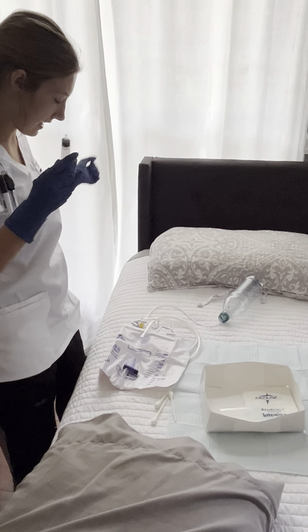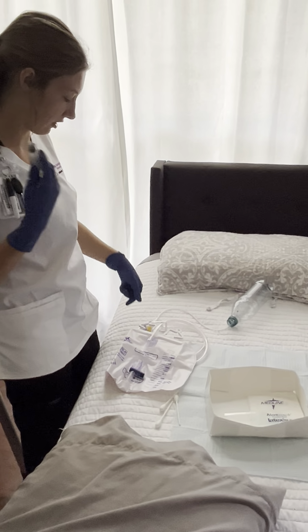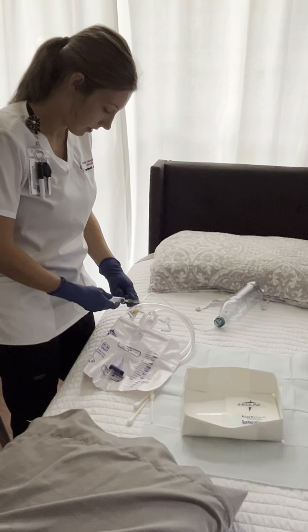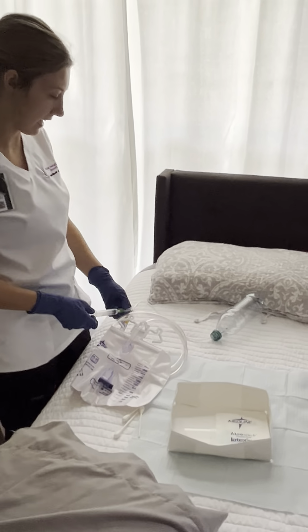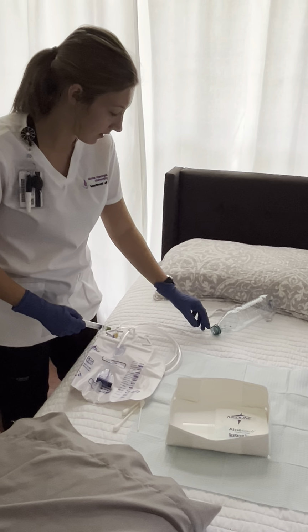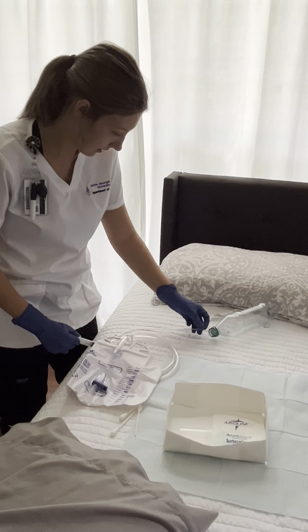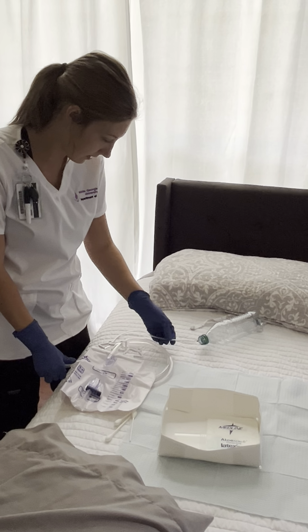So as I was saying, I'm going to attach a new syringe, and I'm going to tell Miss Smith to take a deep breath. Deep breath. And I'm going to pull until I see bubbles, which I do.